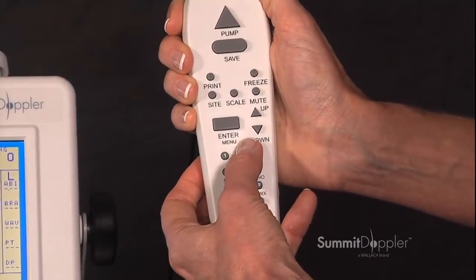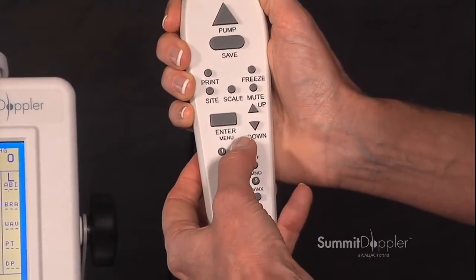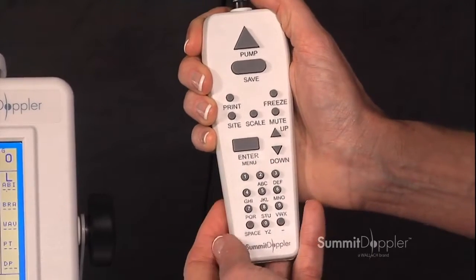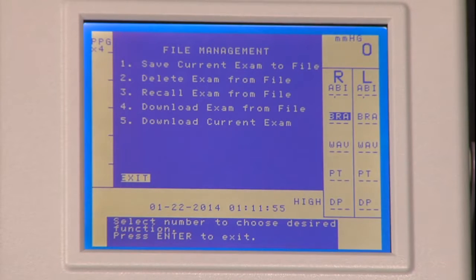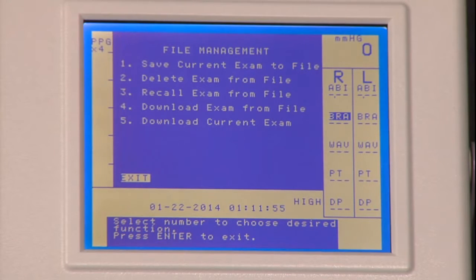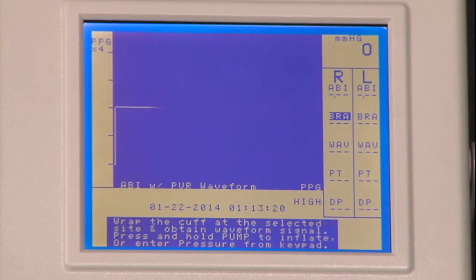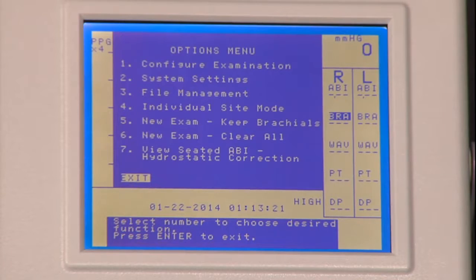On the hand control, pressing number three for file management. This is where you would choose to save your current exam to the file, delete your exam from the file, recall an exam, download exam from file, or download the current exam. Pressing the enter menu key twice to go back to the options menu.